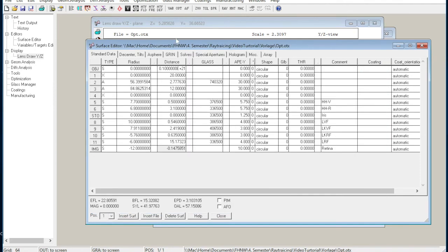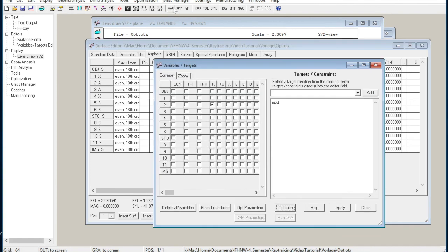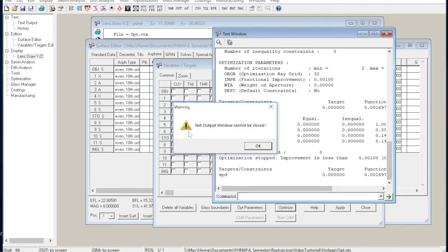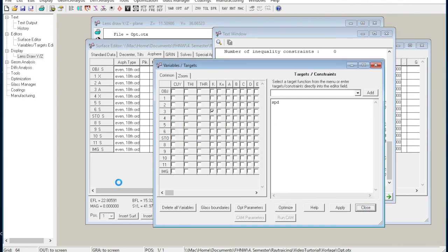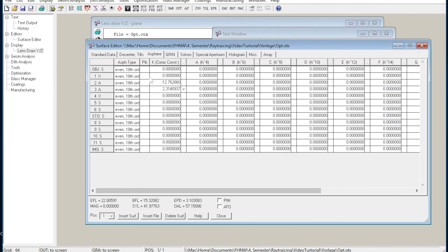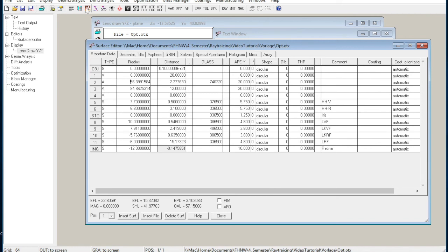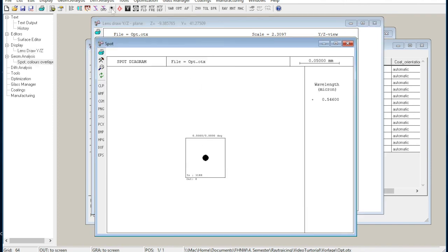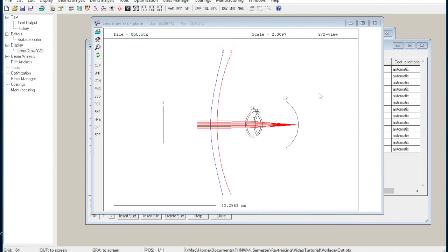And so we optimize the back surface just as we did before with the front surface. Click on K, then Apply and Optimize. And then again we can see the changed value here and the different radius. On the picture we can see the nicely flattened back surface. And also the spot diagram shows us a wonderful depiction. And there we are, we got a nice thin, aesthetic and aspheric spectacle lens.